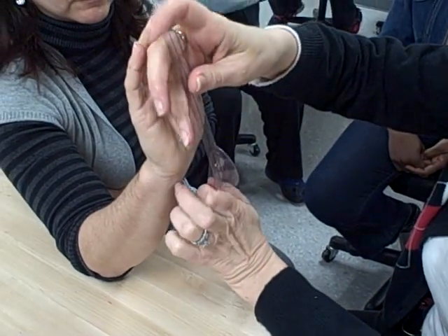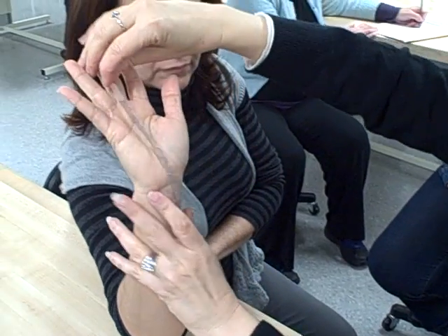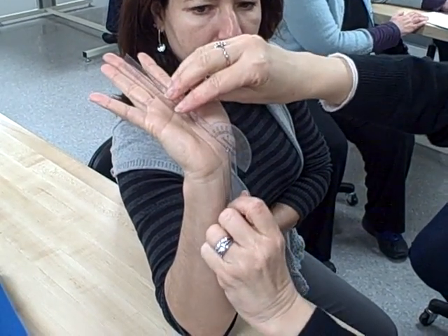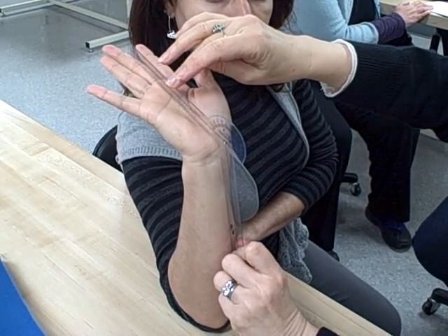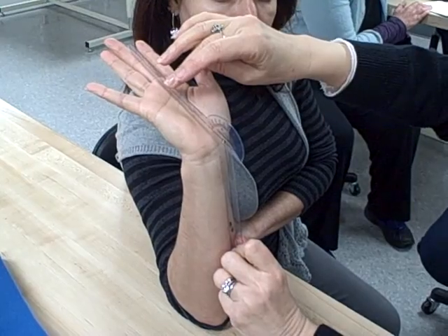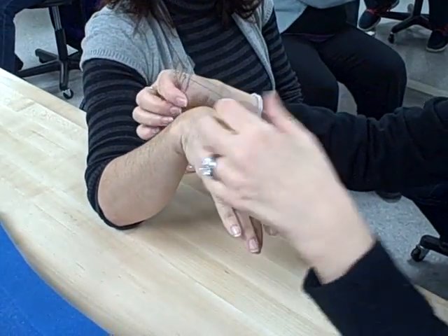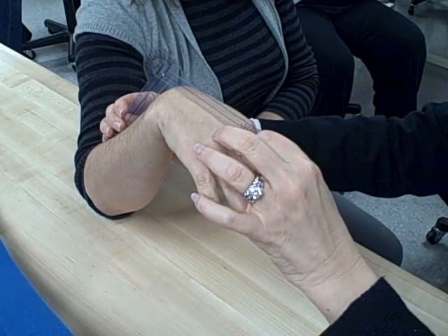So a more accurate measure may be to go right in the middle and lay it alongside the third metacarpal, or right between the fingers, and measure like that for wrist extension. And if we were doing wrist flexion, it would be on the dorsum of the hand right along the third metacarpal.